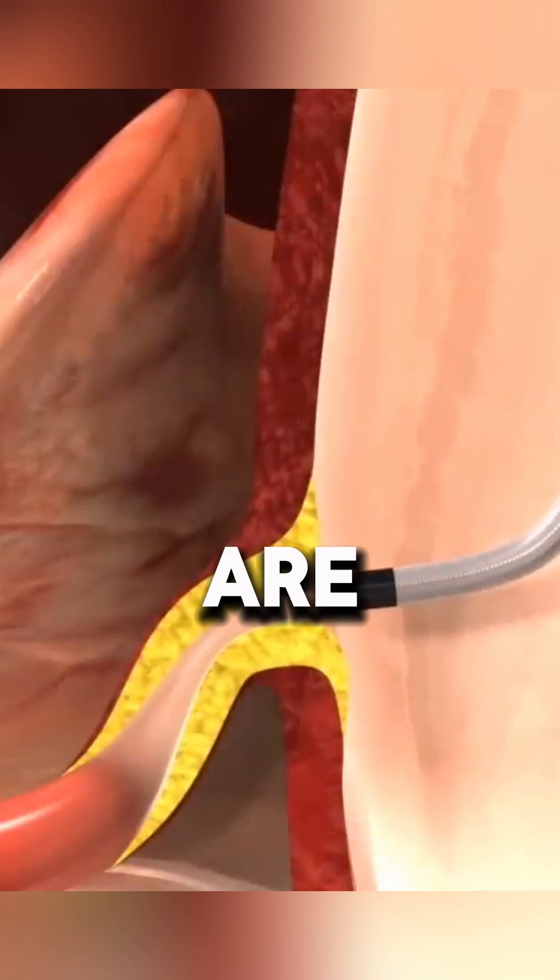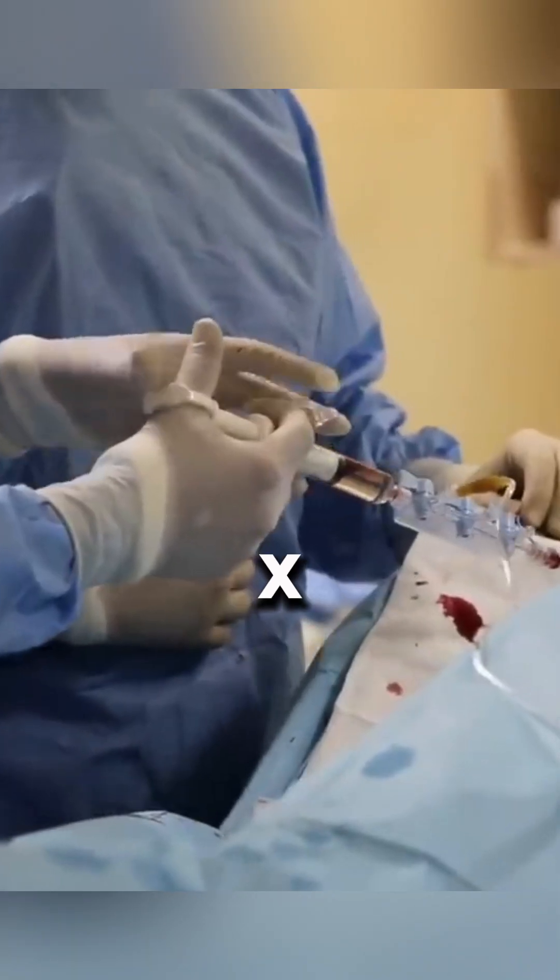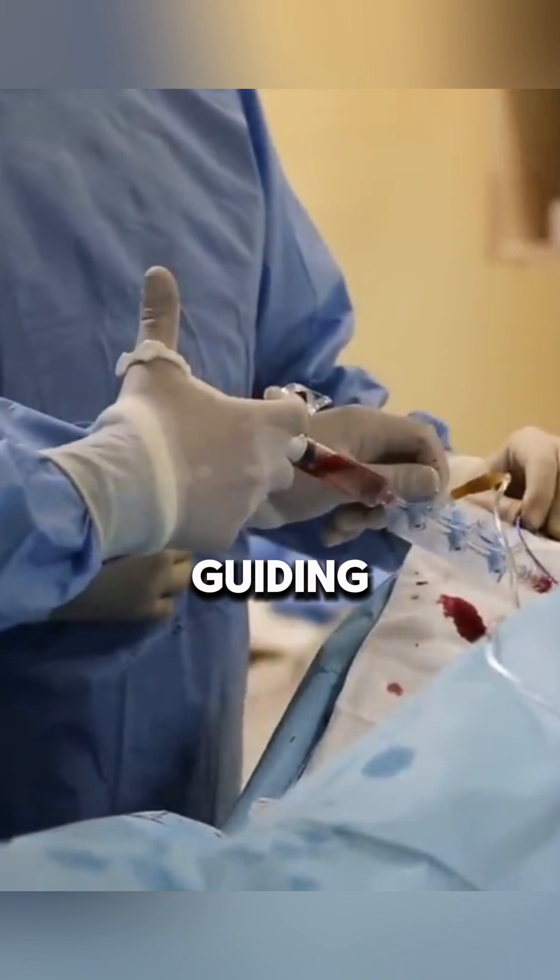Through this sheath, small catheters are guided into the coronary arteries. A small amount of x-ray dye is then injected through the guiding catheter, which may cause a brief warm flushing sensation — this is normal and passes quickly. The dye helps identify narrowed arteries as the doctor watches its movement on a screen.